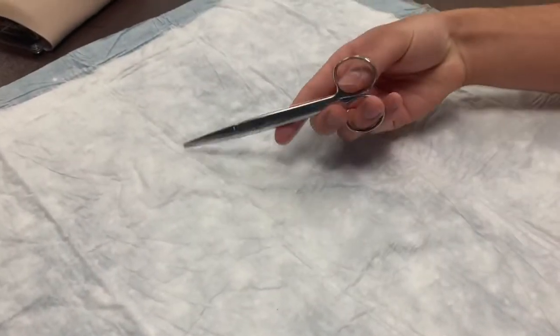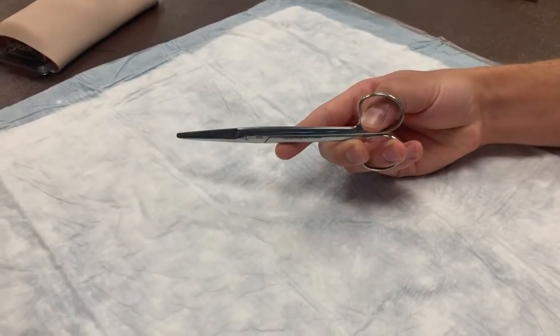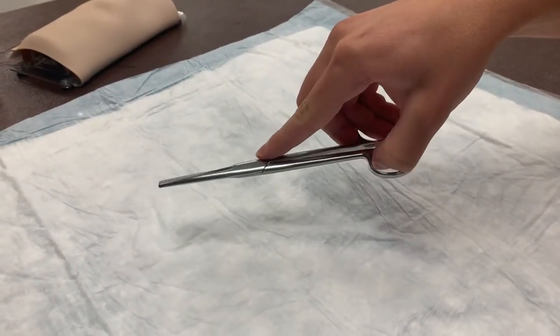Here we see heavy scissors held similarly to the needle driver, with your thumb and ring finger in the rings and your index finger extended for stability. If you feel shaky, you can stabilize the scissors with your other hand, although that's not pictured here.